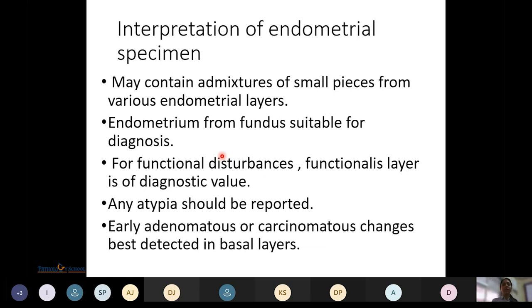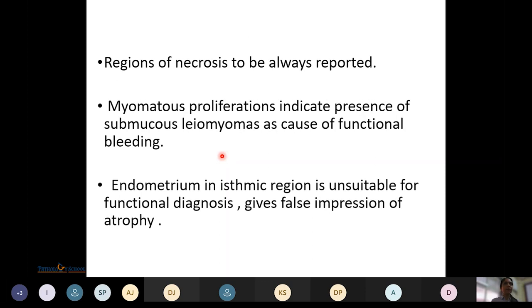Endometrial specimens may contain admixtures of small pieces from various endometrial layers. Endometrium from the fundus is preferred for diagnosis since the isthmus is not hormone-responsive. For functional disturbances, the functionalis layer is of diagnostic value. Early adenomatous or carcinomatous changes are best detected in the basal layers. The functionalis layer is preferred because it is the most hormone-responsive layer and contains surface lining epithelium, satisfying the criteria for adequacy. Regions of necrosis, myomatous proliferations, and isthmic endometrium should all be reported; isthmic endometrium may give a false impression of atrophy.